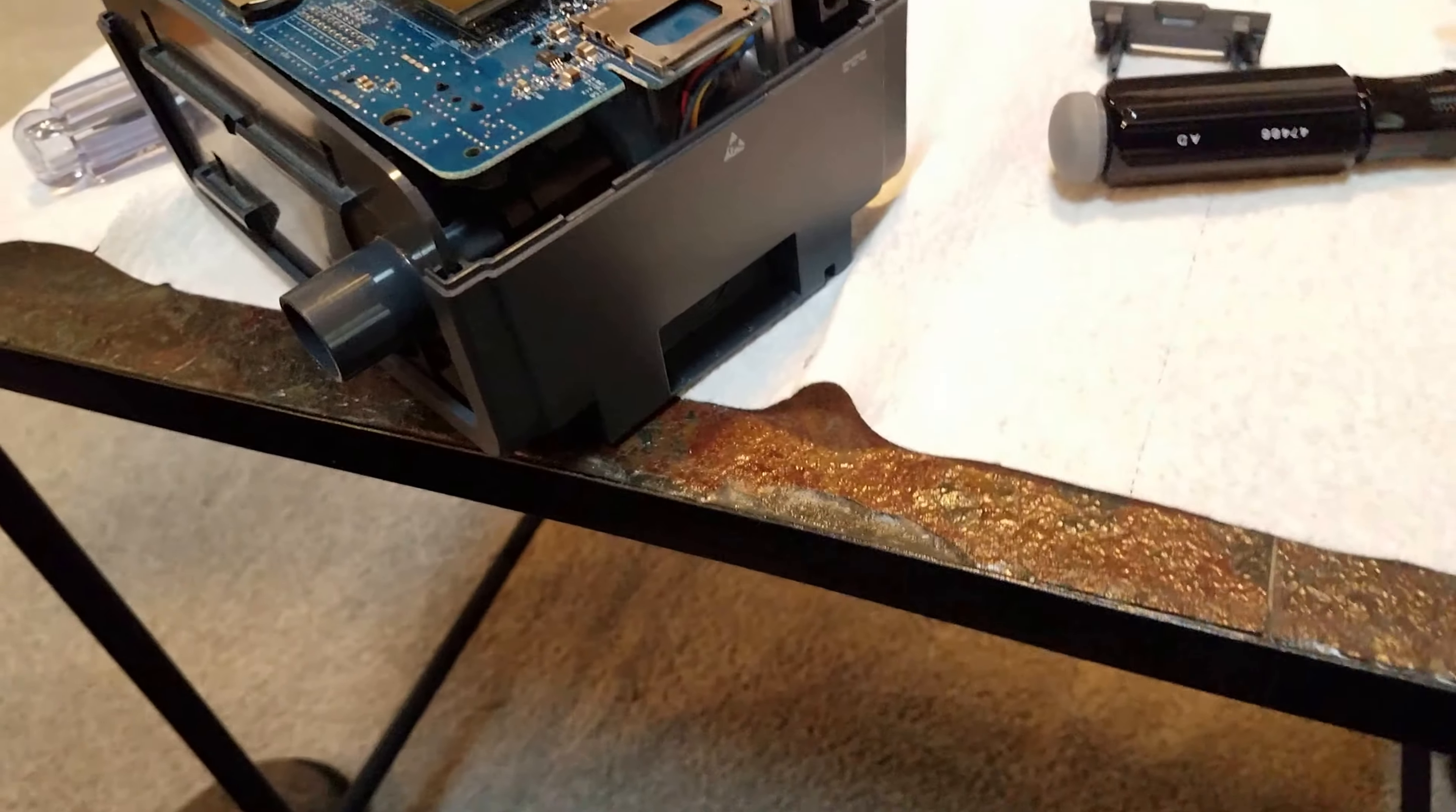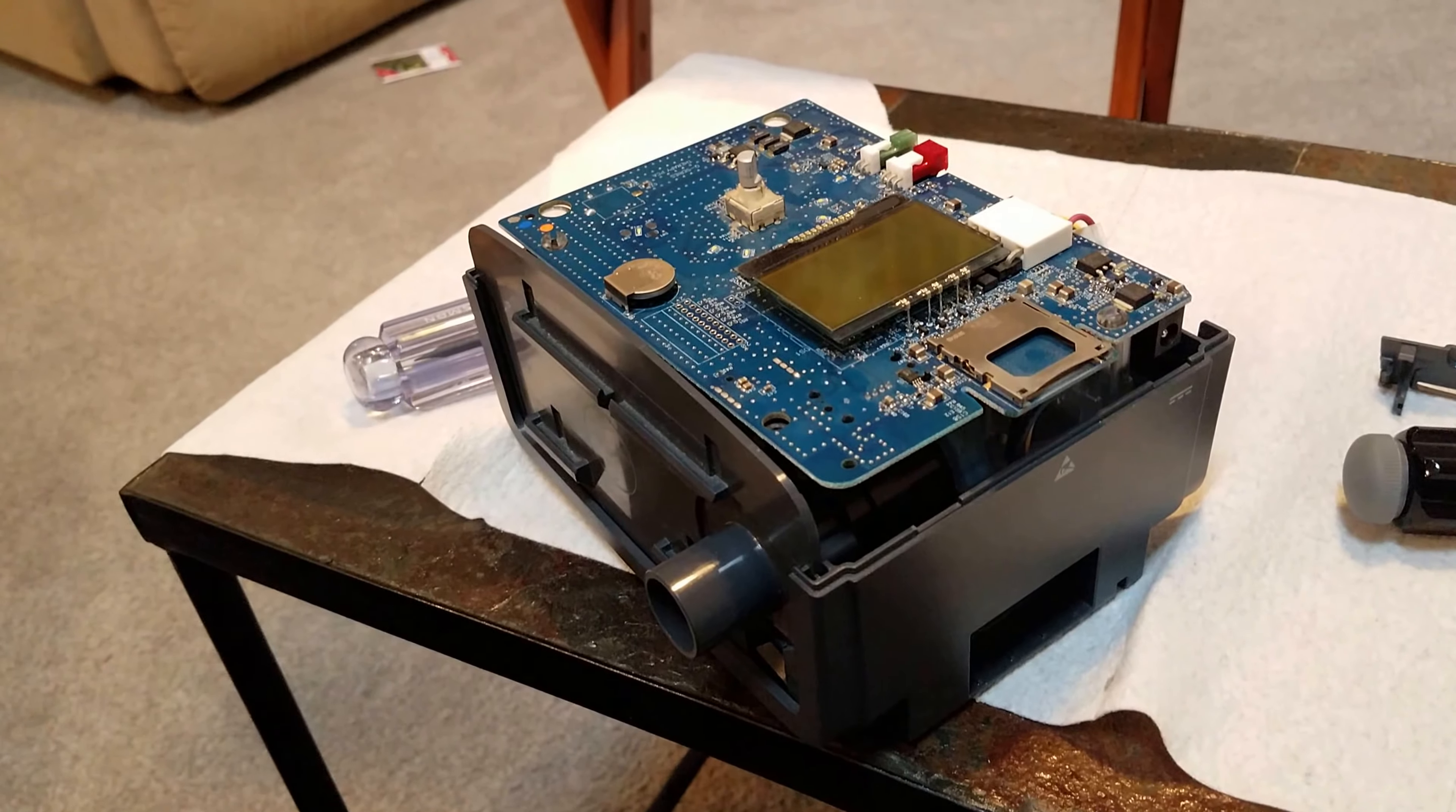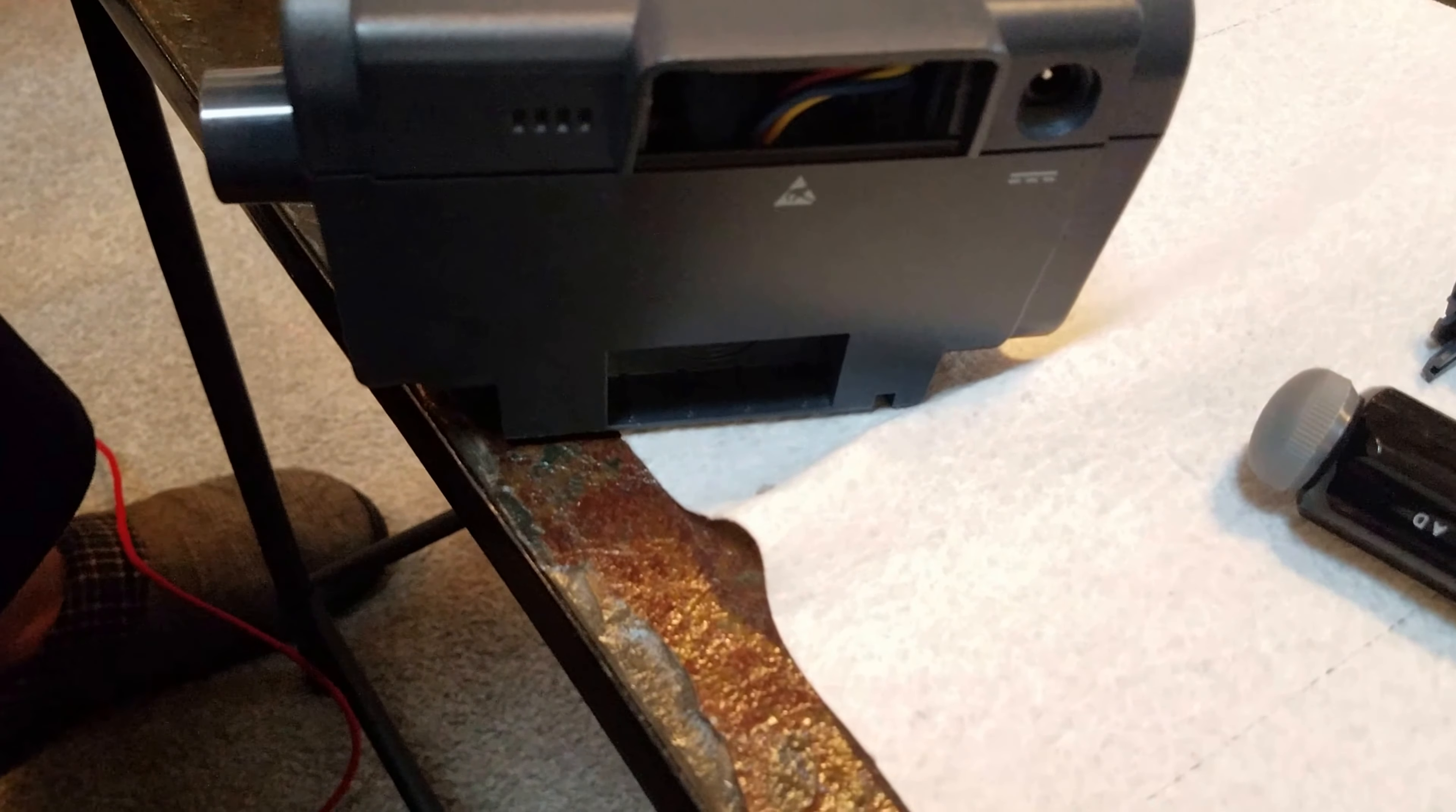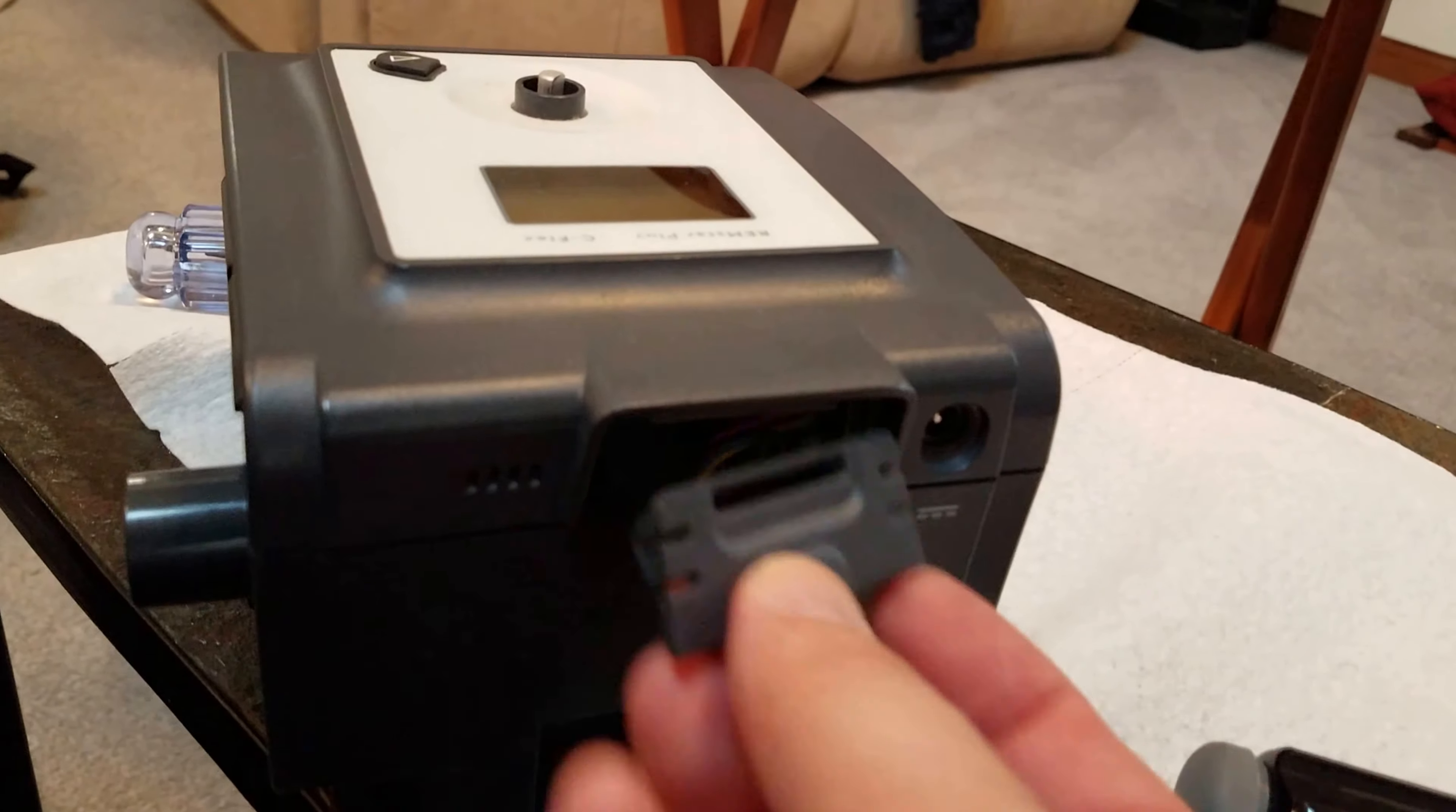Let me go through this in a moment. I need two hands. So you don't put that little tray on right now, you put it on afterward and then it clips on. That's it. This sucker just pushes on. Let me get it in there facing the right way. It's difficult one-handed and also looking at the screen of the camera.